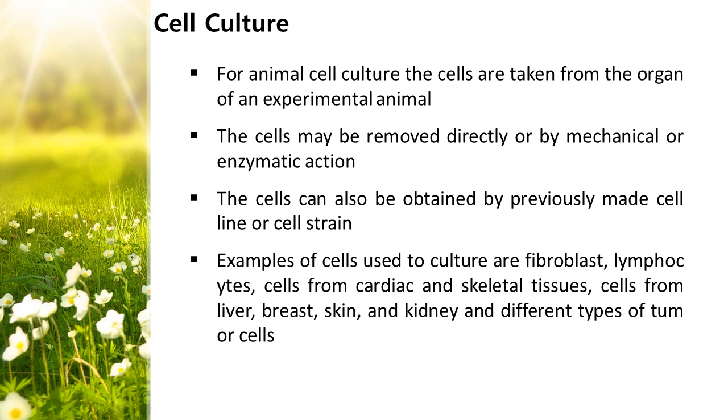Using this, we can maintain the cell line, or cell strain, which is preserved for future purposes or for further processing.